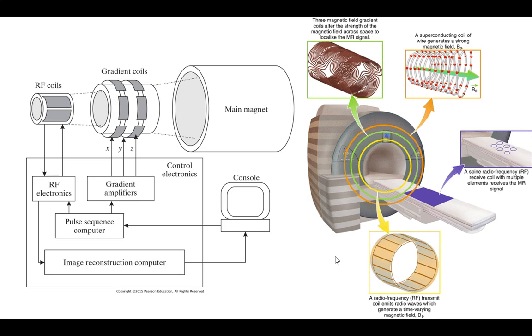This doesn't actually show all of them. There are also little shim magnets that we put in that allow us to adjust to try to linearize this. So tuning in the morning, there are these little shim magnets that go in. It's not part of the regular running, right? Well, they're on in the regular running, but they're set at whatever they had been in the morning. So you just use them to get the field to go right. It doesn't show here, but there are also lasers set up within the room to do the alignments. You need the lasers because you have to align, and B, you don't want anything in the range of it. But you can see there are X, Y, and Z ones.